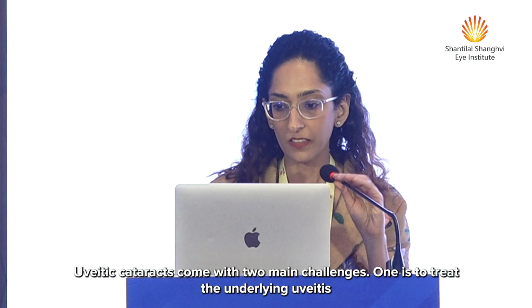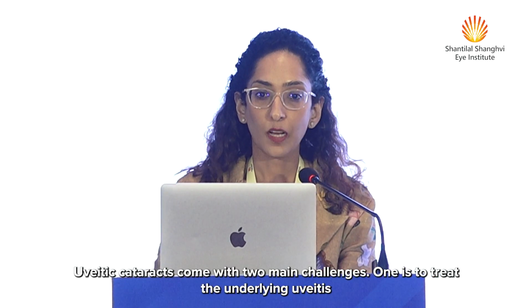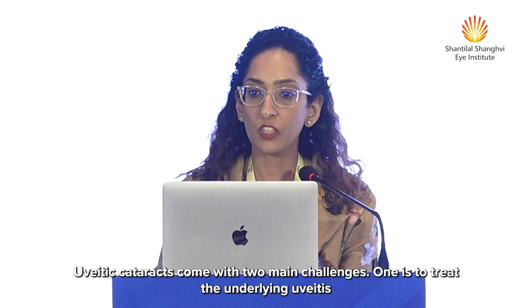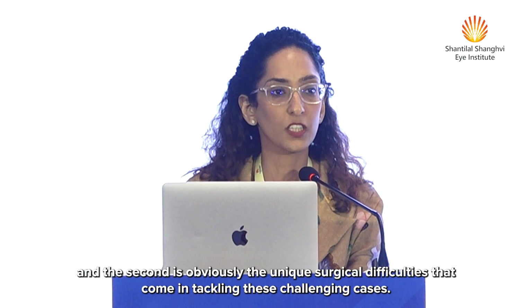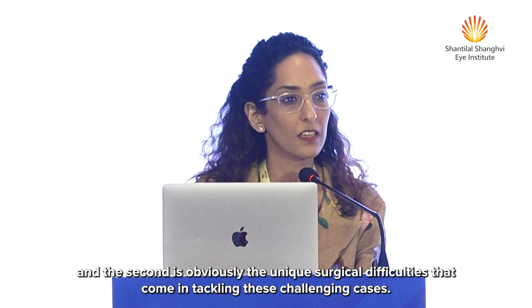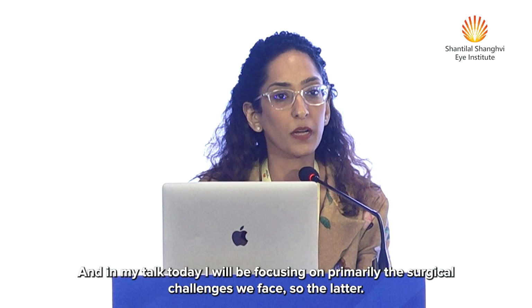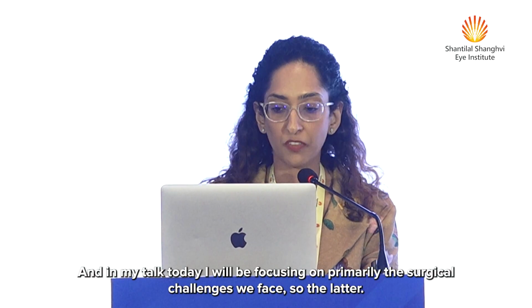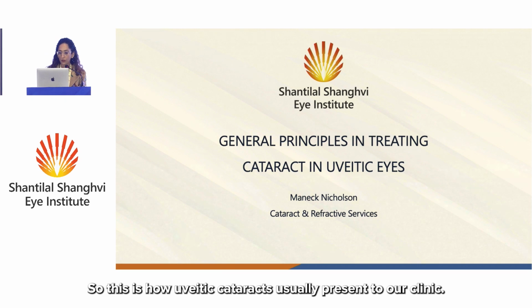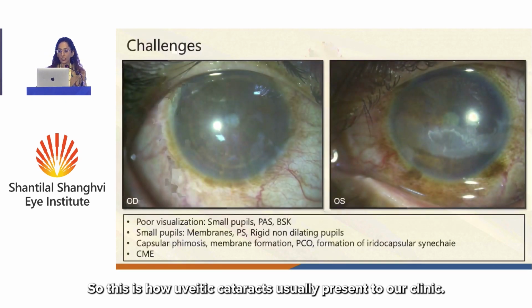Good afternoon, everyone. So today I'm going to talk a little bit about the general principles of treating cataracts in eyes with uveitis. Uveitic cataracts come with two main challenges. One is to treat the underlying uveitis, and the second is obviously the unique surgical difficulties that come in tackling these challenging cases. In my talk today, I'll be focusing primarily on the surgical challenges we face, so the latter. So this is how uveitic cataracts usually present to our clinic.